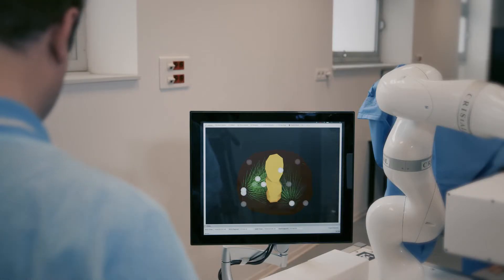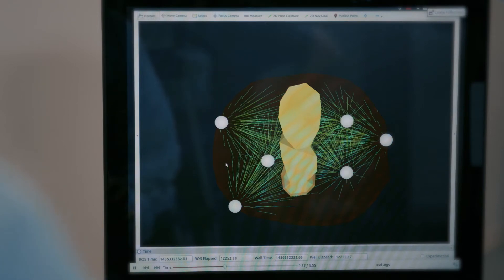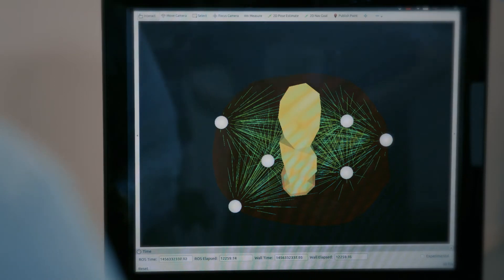The insertion sites are chosen using self-developed software. It allows placement of a virtual grid on 3D prostate imaging and indicates optimal straight or oblique trajectories with identified doses for each localized target.